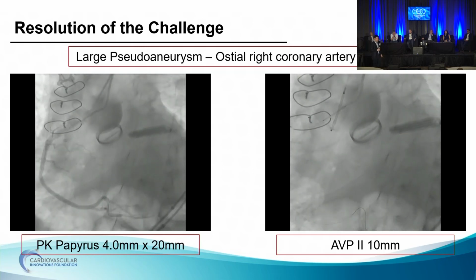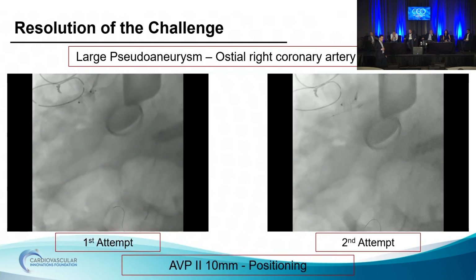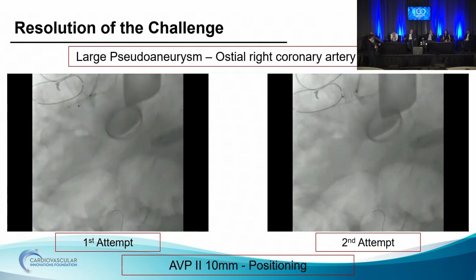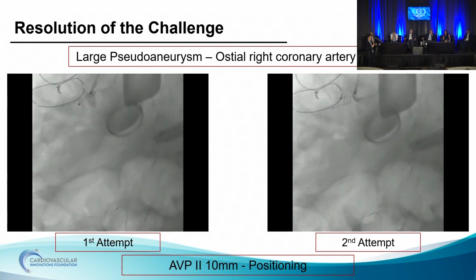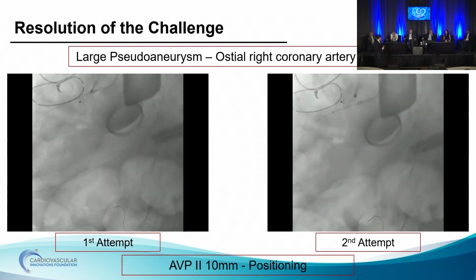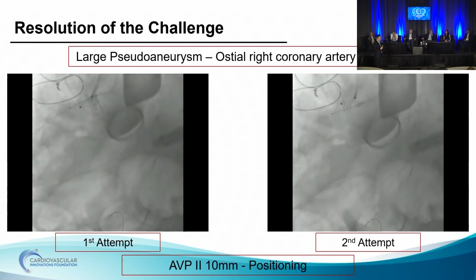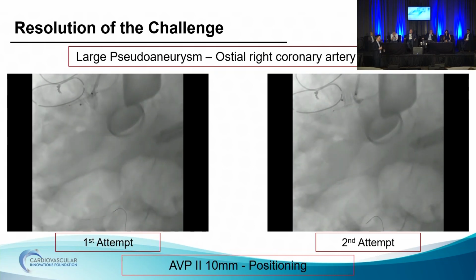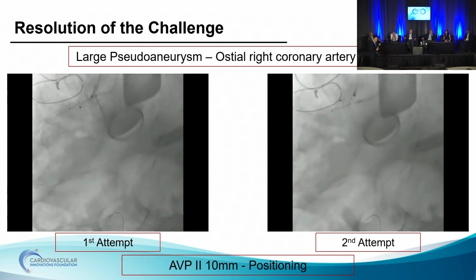more. The second problem is, how do you put your discs? Because your pseudoaneurysm ostium is so small, we traditionally say one disc on one side, you try to put the nice middle disc in between, and then you use the third disc as a closure on the other side. So that was our initial thought, but you can see our first attempt, in reality all three discs are inside the pseudoaneurysm, so it couldn't really work.